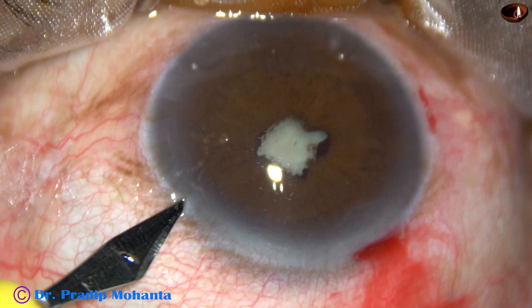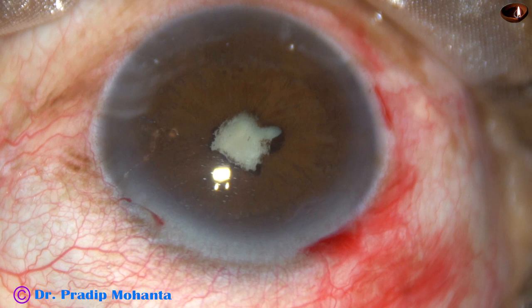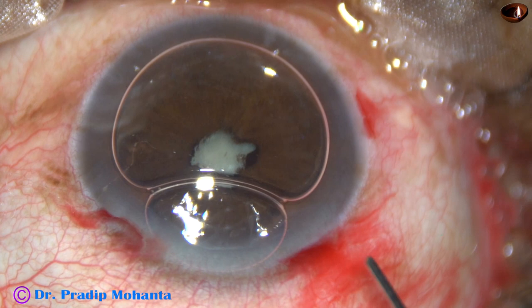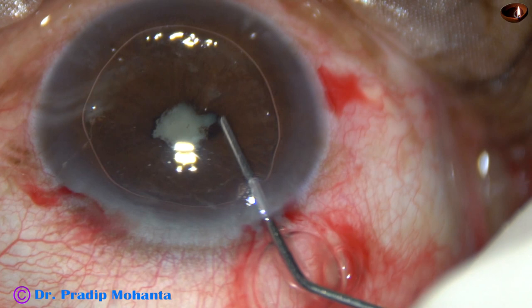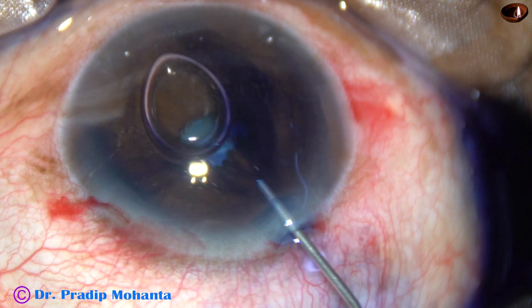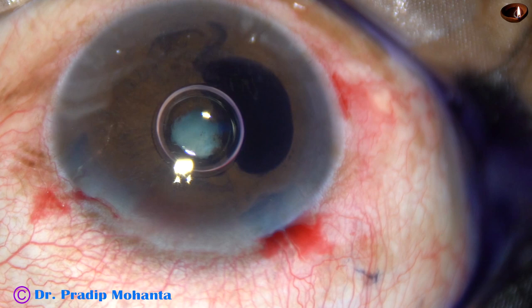Now I am going to inject an air bubble. And beneath this air bubble, I am injecting trypan blue dye in the posterior chamber through this small opening. There is posterior synechia all around except at 9 o'clock. The dye is coming out gradually through that small opening, and now the dye is washed out.